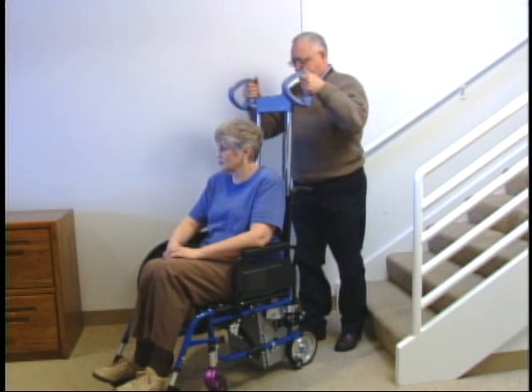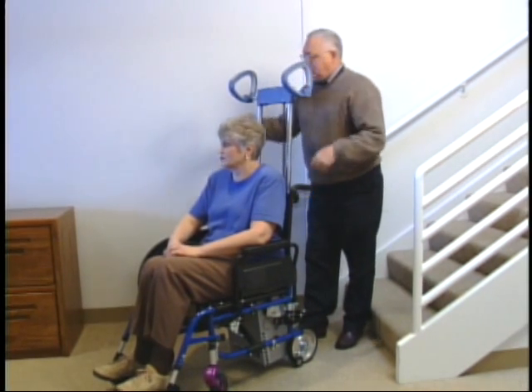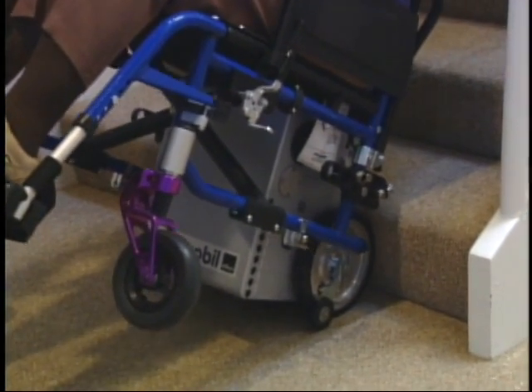Now the attendant raises the handlebars to a comfortable height. Pulling the wheelchair backward towards the stairs, the wheelchair gets placed in a balanced position.